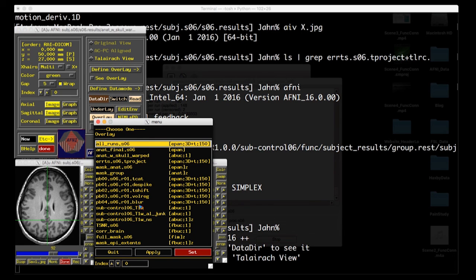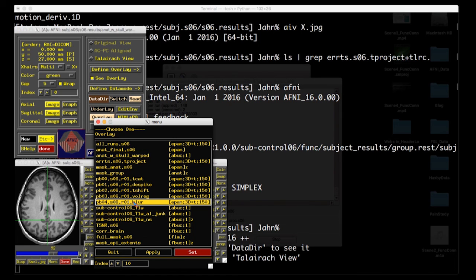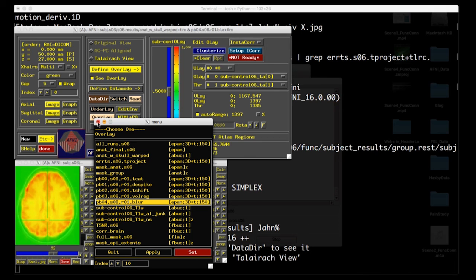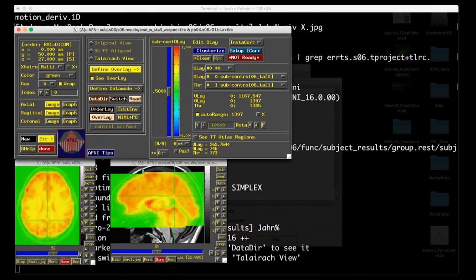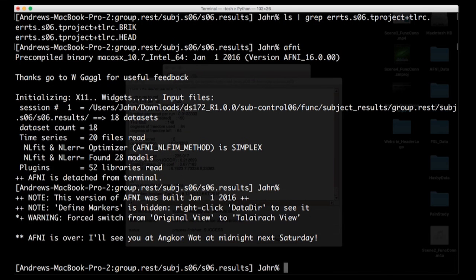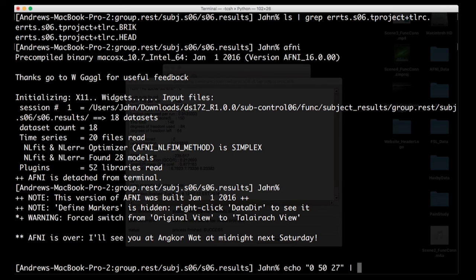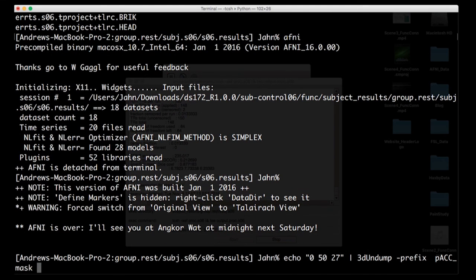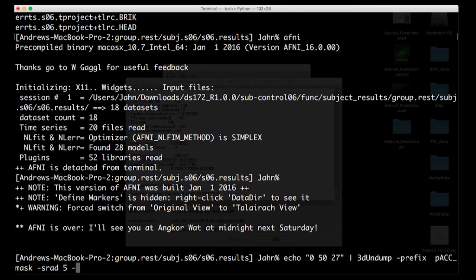That's what we're going to be using for a command called 3dUndump. Also, while you're at it, you may as well check things like, do all my pre-processed images line up relatively well? Yeah, they seem to. There seems to be a good amount of alignment between the two. So also make sure to check that as well. So what I'm going to do with those coordinates, again, these are just ones that I've picked. You can base them off of other papers since all these images have been warped to a standardized space, or you can just base it on individual anatomical anatomy if you want to. I'm going to feed that through a pipe to 3dUndump.